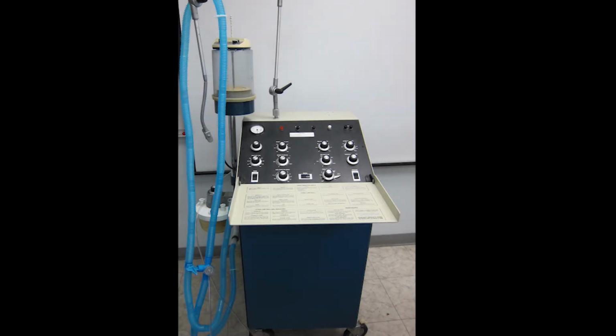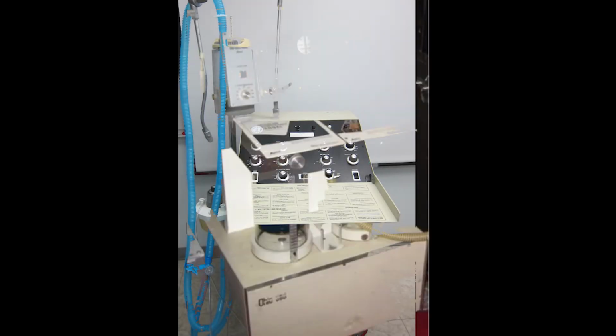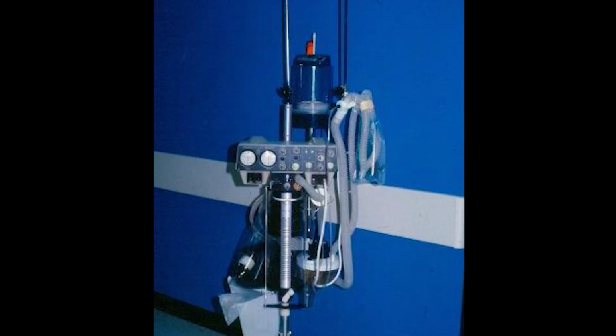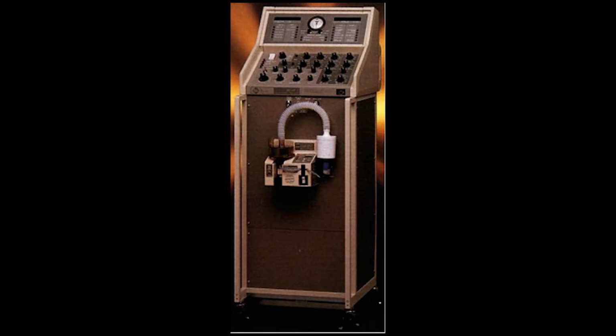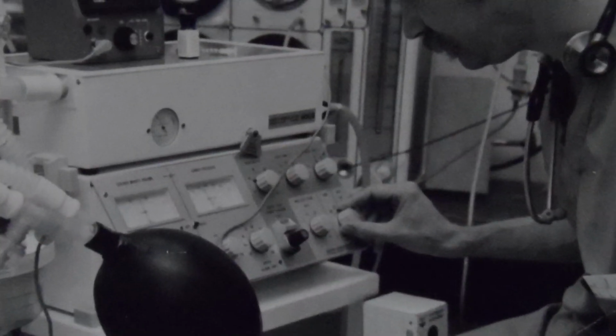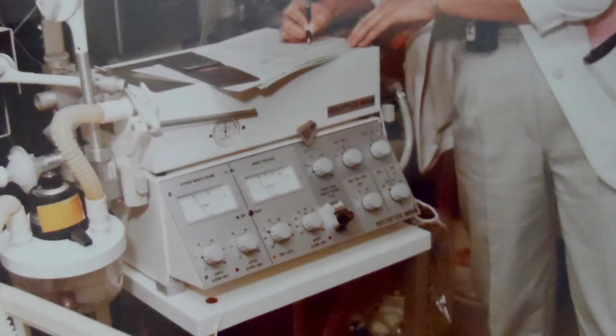The second generation of ventilators started with the Puritan Bennett MA1. This generation of ventilators offered PEEP, but was still only volume controlled. They had some patient monitors, such as tidal volume, respiratory rate, and pressures, and were able to alarm high pressure, high respiratory rate, and low tidal volume.